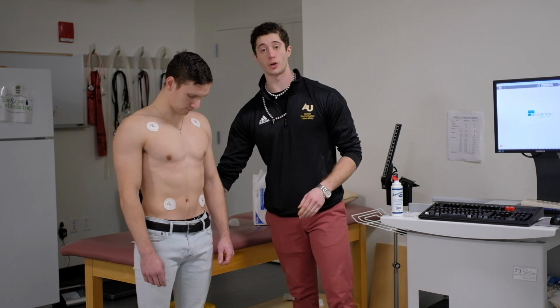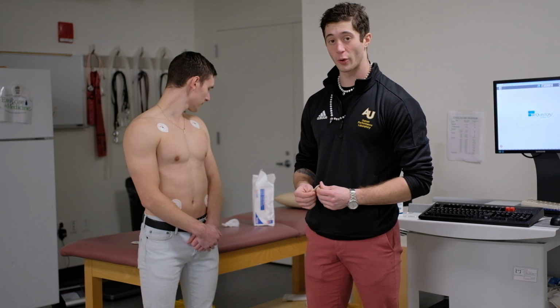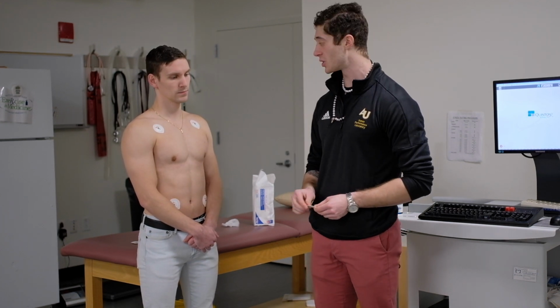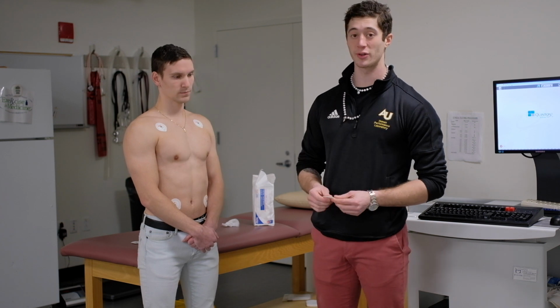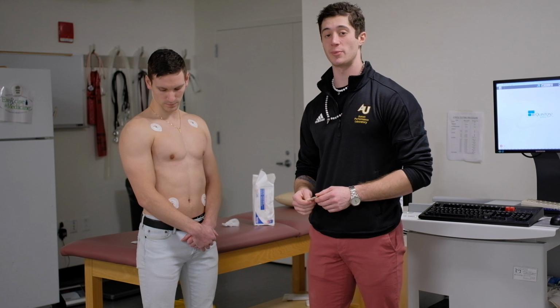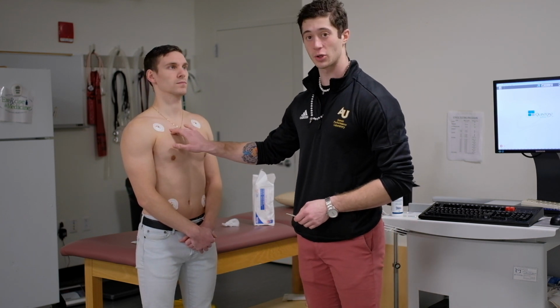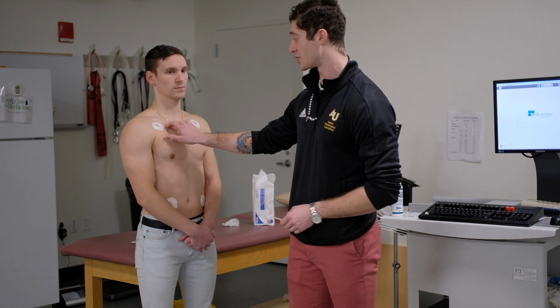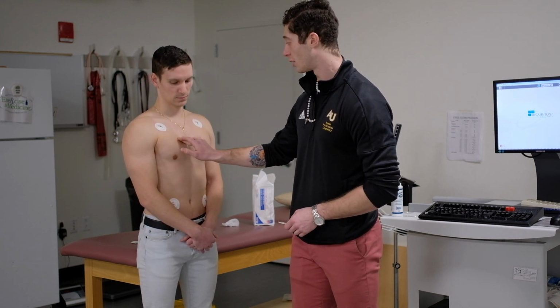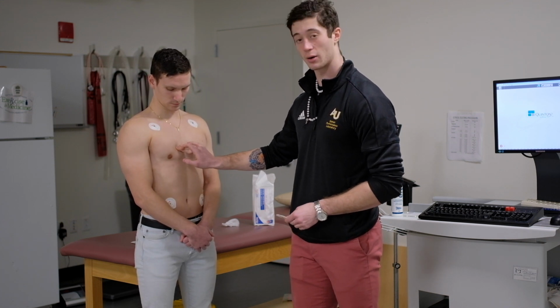The next electrodes are going to be the V-leads. V1 and V2 go in the fourth intercostal space on either side of the sternum. V1 is going to be on the right side of the sternum, and V2 is going to be on the left. The way that we find them is we palpate the intercostal spaces. We find the first intercostal space, and we use our fingers to find the fourth intercostal space, which is approximately here.